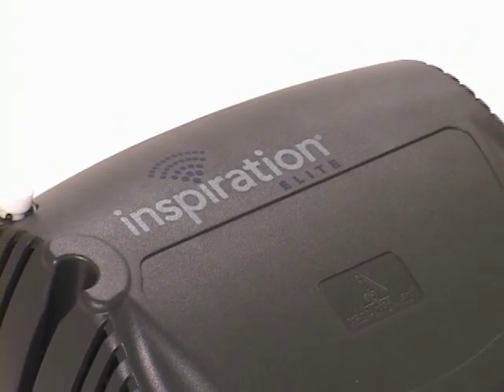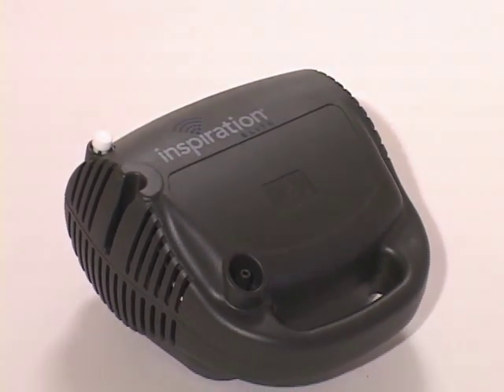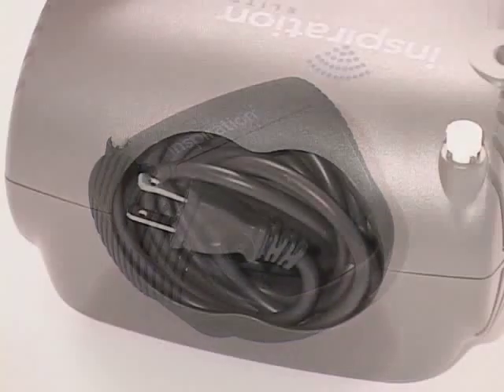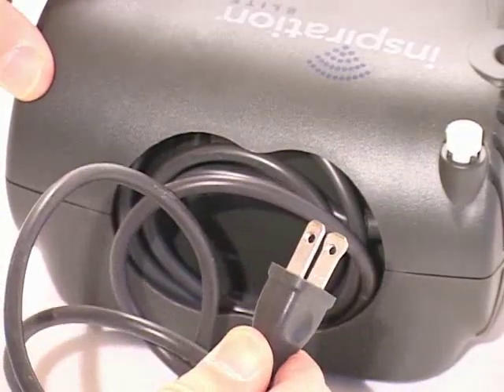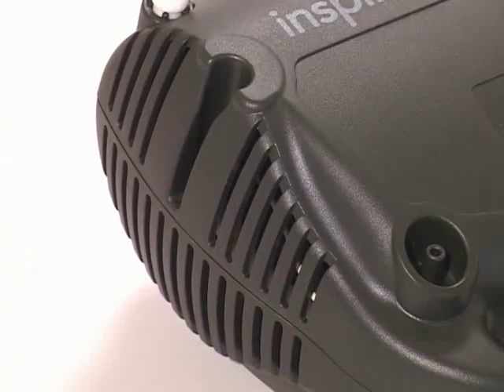The Inspiration Elite Compressor provides air pressure that works with your nebulizer handset to turn your medication into a fine mist. When using your Inspiration Elite, place it on a hard flat surface, such as a table or counter. Remove the power cord from the rear storage compartment. Plug the compressor into an appropriate electrical outlet. Make sure the air vents on either side of the compressor are not blocked.